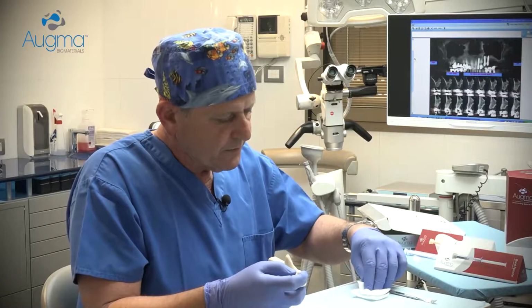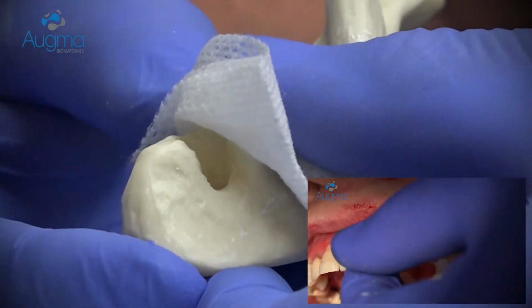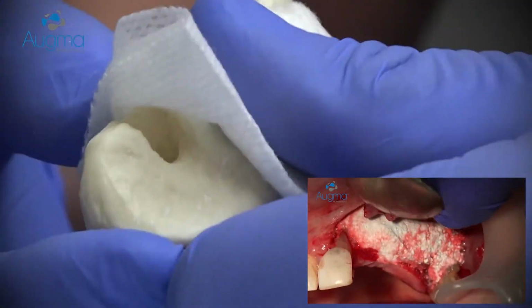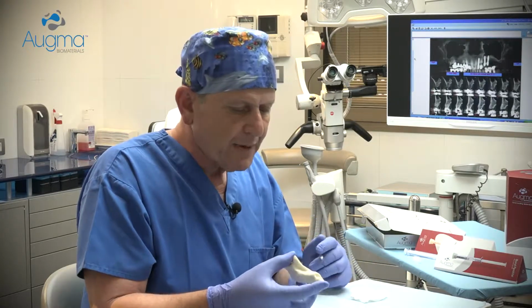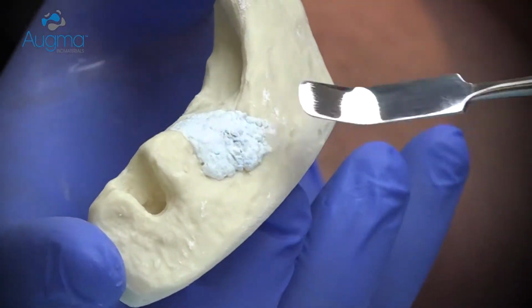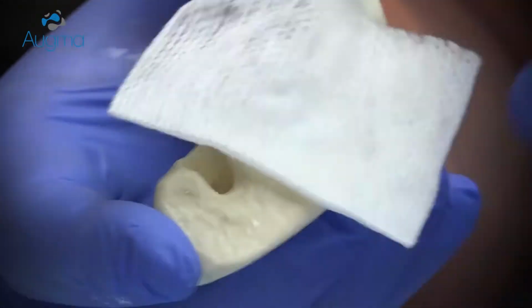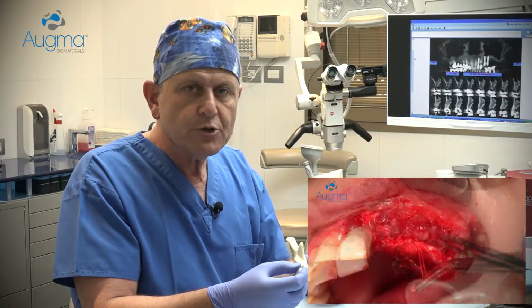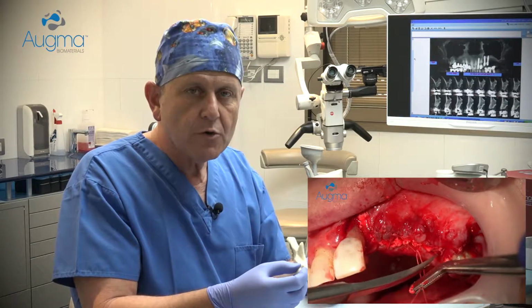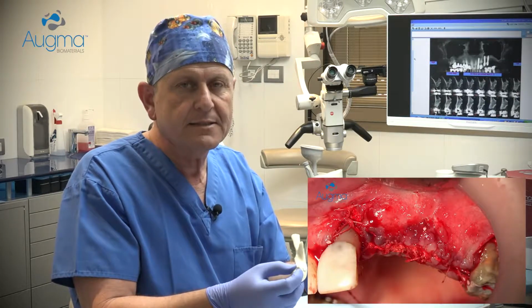At this stage, you should take a dry gauze, place it above the cement and press it firmly for 3 seconds. Now the material is already well stabilized. If you need to shape it, you can shape it a little bit and press it again for 3 seconds, and you can close the flap. However, it's very important that your soft tissue is primarily closed and well sutured. That's all, simple as that.